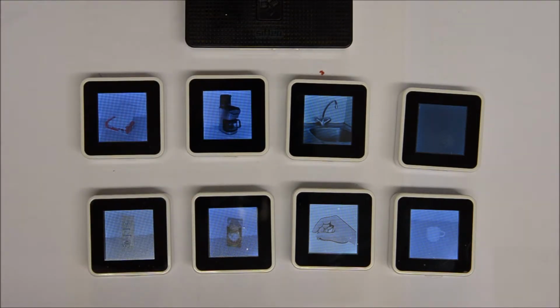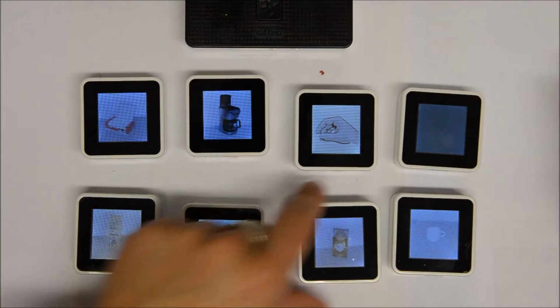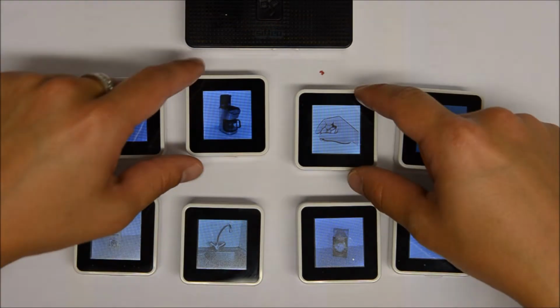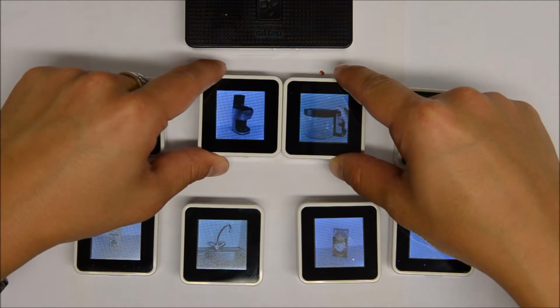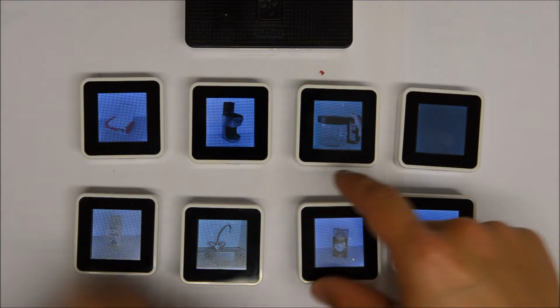So you open that. The next option will be taking the jar out, and putting it under the tap, basically what it said. This is the second level reminder. It will repeat the same audio actions with flashing cubes. That means you have to touch all the cubes together. As you can see, there's a little animation there, and now the hand is actually holding the jar.